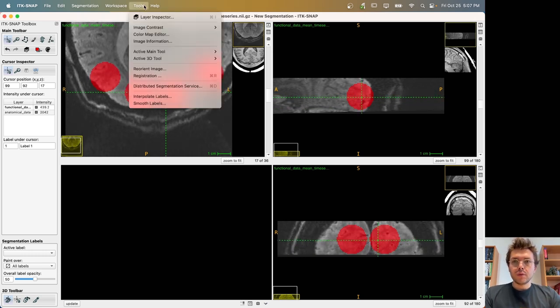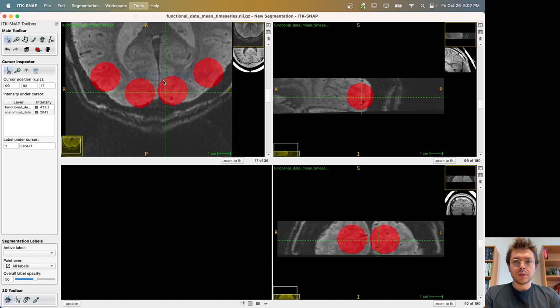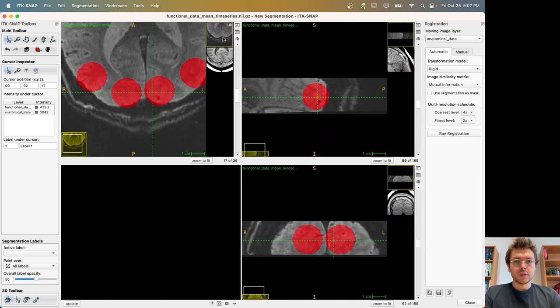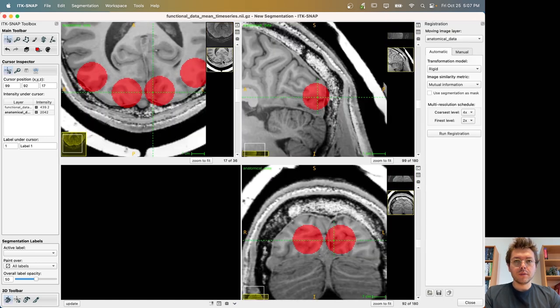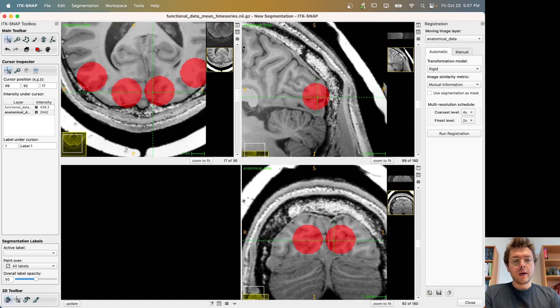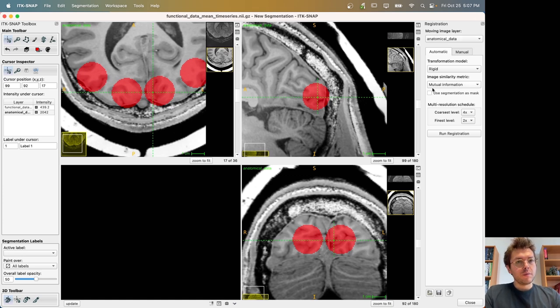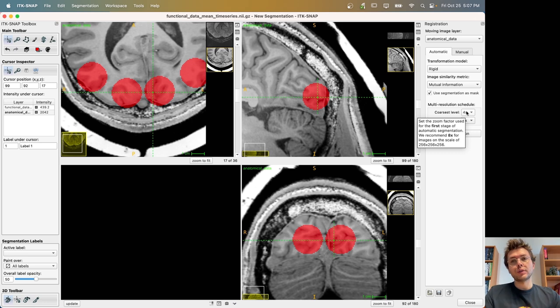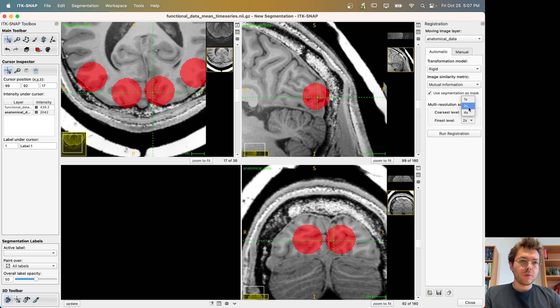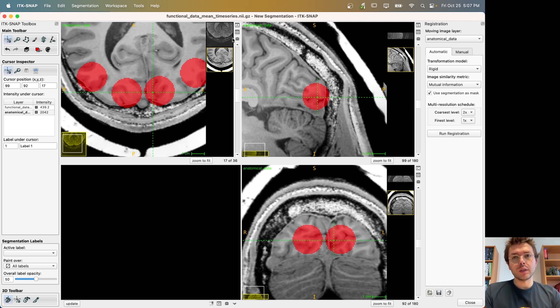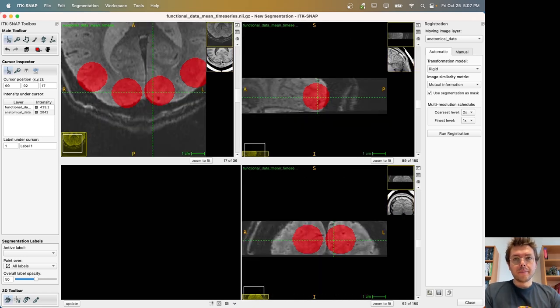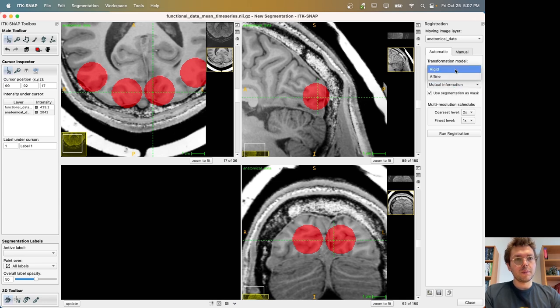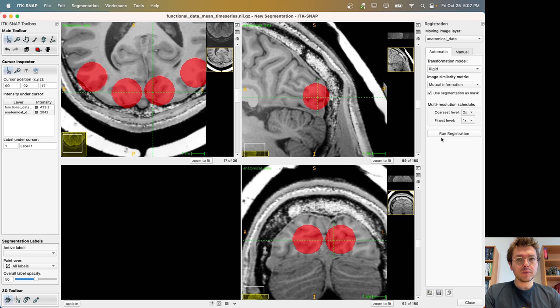Then we are going to go to tools and registration part of ITK-SNAP. You can switch between two images here. You can also use the brackets in your keyboard to quickly switch between them. Now, there are two things that we are going to do. First, we will click on the use segmentation as mask. And since these two images are already very close to begin with, we do not want to have a search that is at a very coarse level that can drive things off. We can start with the 2x level. And our finest level will be 1x. This is the same resolution as our data and not downsampled. We have this mutual information metric. There are some others to choose from. You can either have rigid or affine linear transformation. Now, we are going to run it and see what's happening.